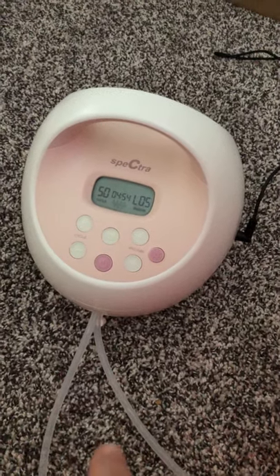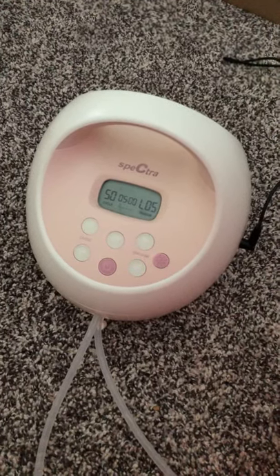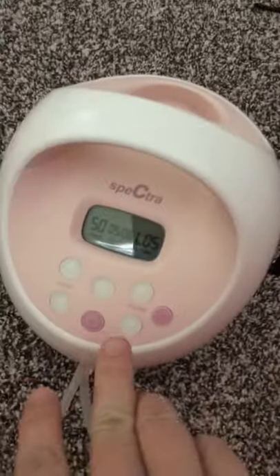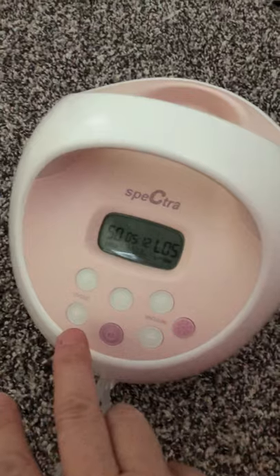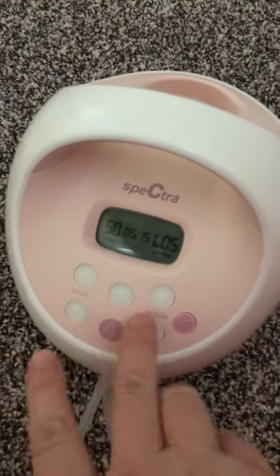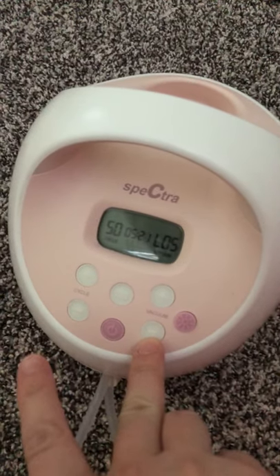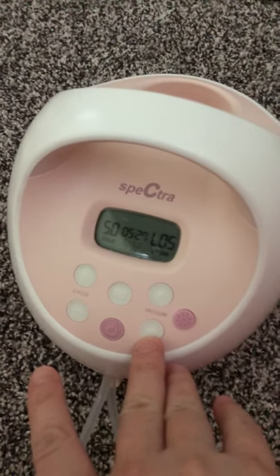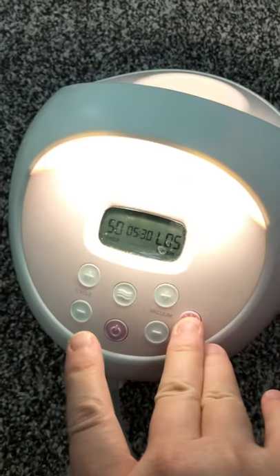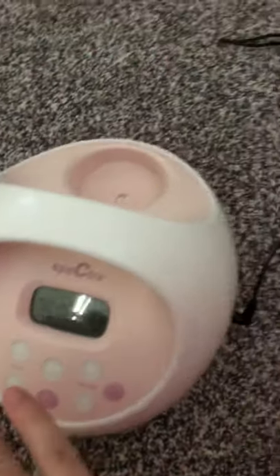I'm not going to show you because I'm literally pumping right now, but listen how quiet it is — it's so quiet you can barely hear it. Right here you have your power button, you have your cycle that can go on and off, which is how fast it goes, you have your vacuum here which is how hard you want it to suck. I start at five and I move up to ten. It has a light of two different brightnesses, which is essential for the nighttime.